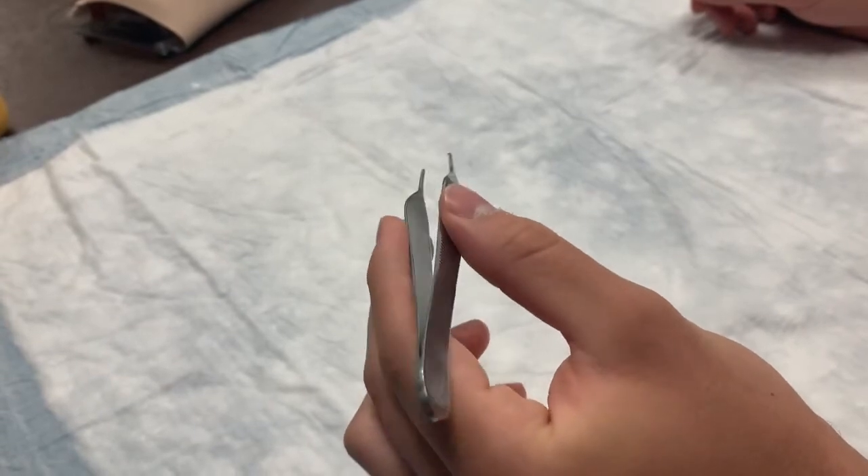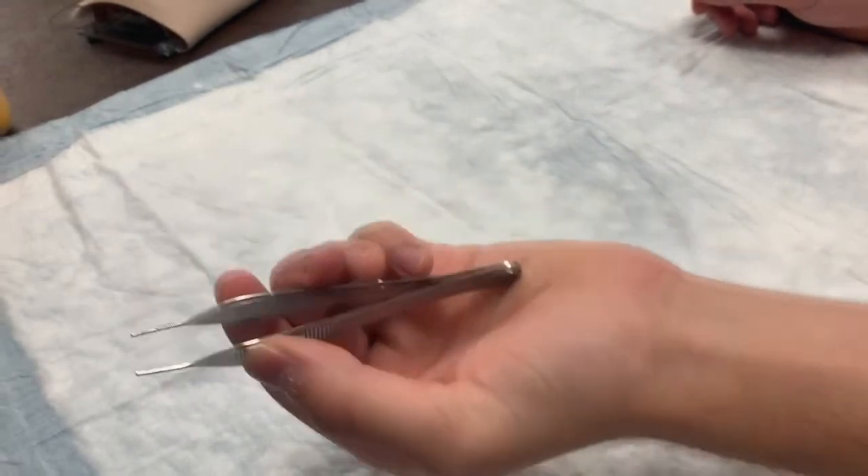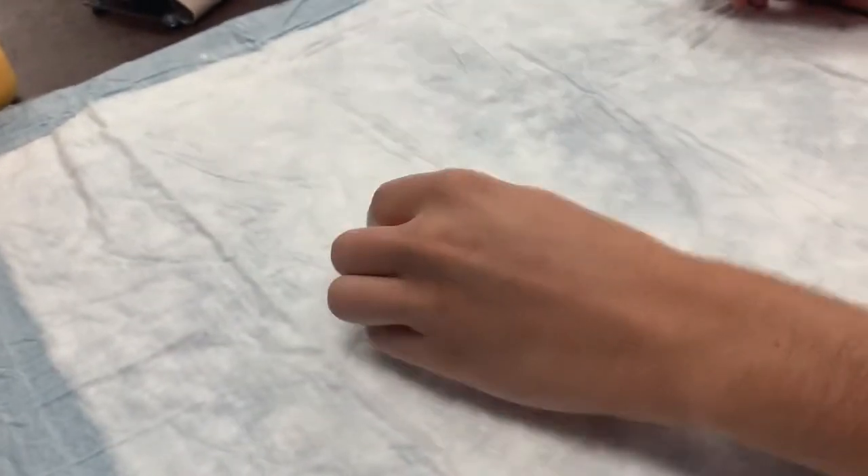A common way to hold forceps incorrectly is to have the top of the forceps in the palm of your hand, similar to how one would hold kitchen tongs.